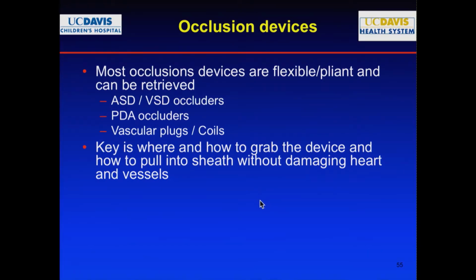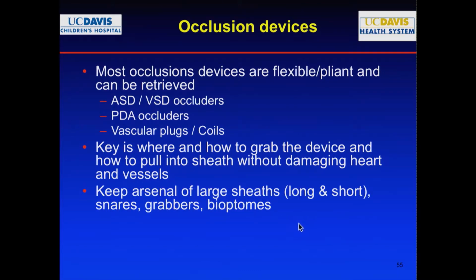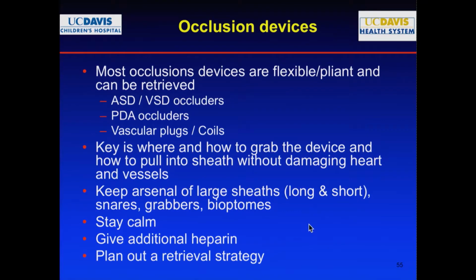That's what you really have to learn how to do. You have to have a big arsenal of big sheaths, long and short, snares, grabbers, different kinds of bioptomes. Again, stay calm, you give some additional heparin, and you come up with a retrieval strategy.